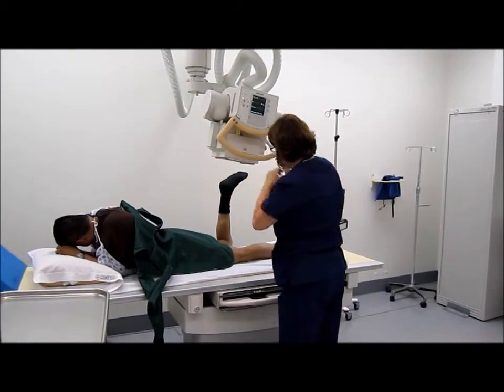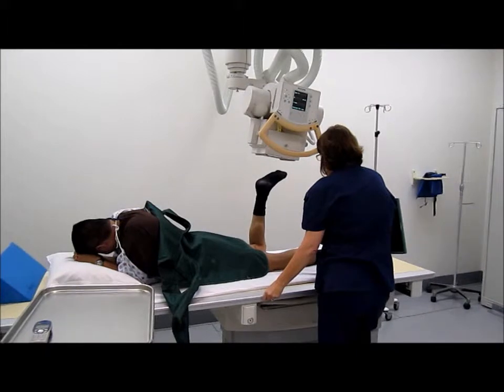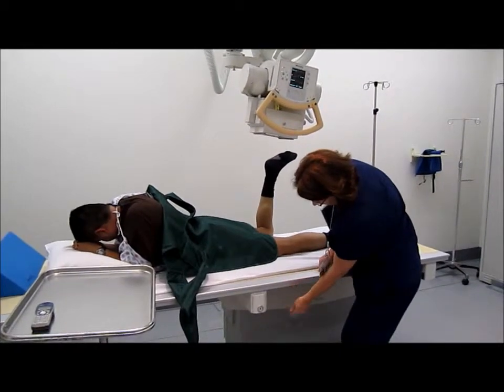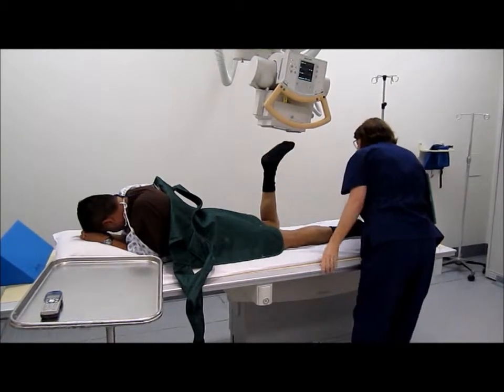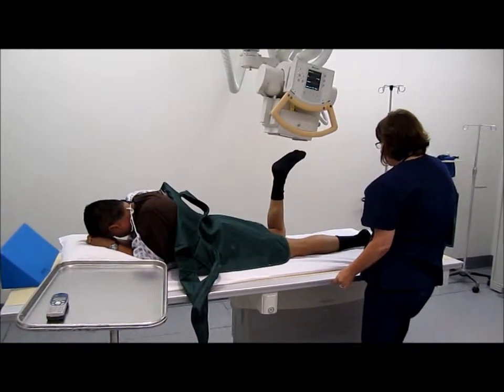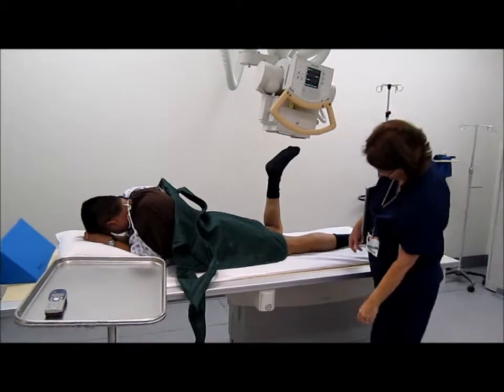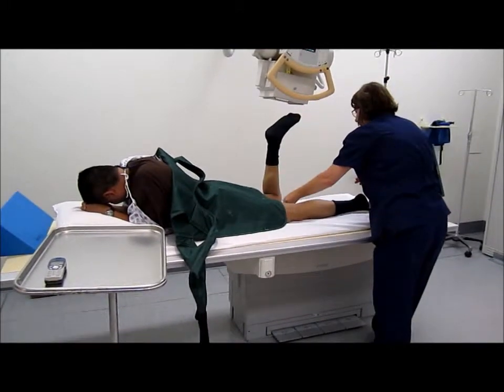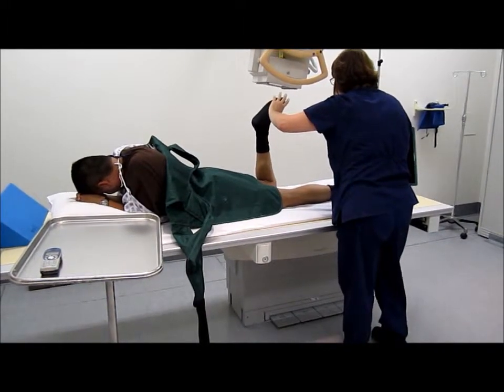And I'm going to center my patellofemoral joint. Hold real still.